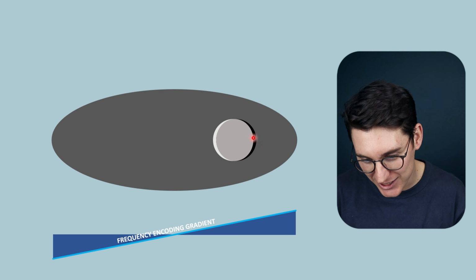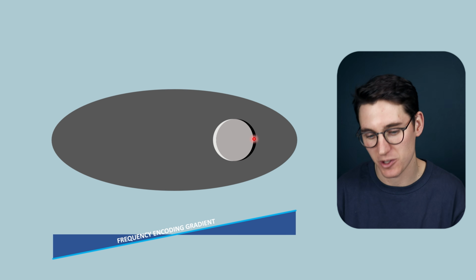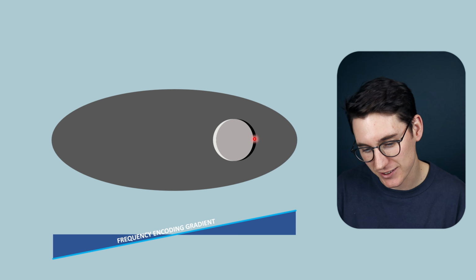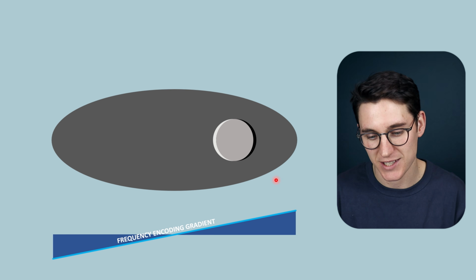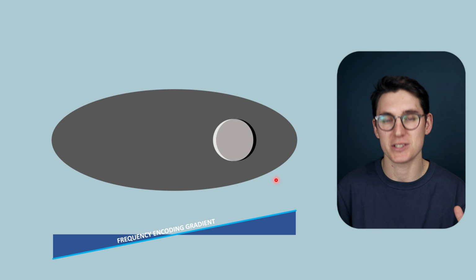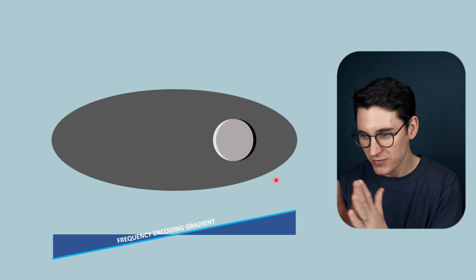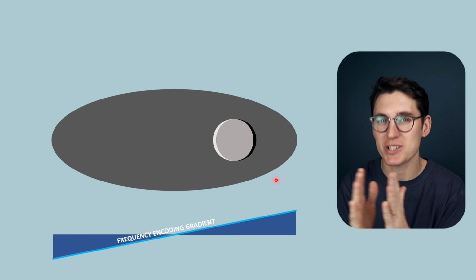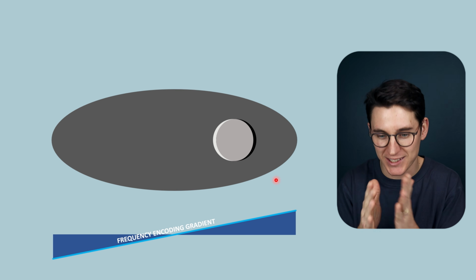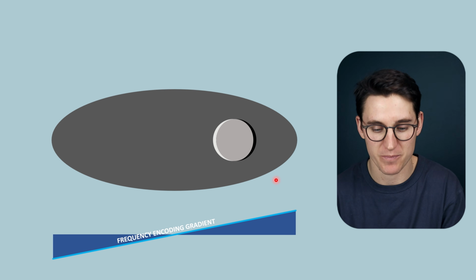And the fat that is actually here, truly in the anatomy of the patient, is being misregistered at a different place. And we get no signal at this part of the fat-water interface. This is essentially what the chemical shift artifact is, and it predominantly happens in the frequency encoding direction. Chemical shift is a difference in frequencies, and we misregister those differences in frequency, leading to this chemical shift artifact.